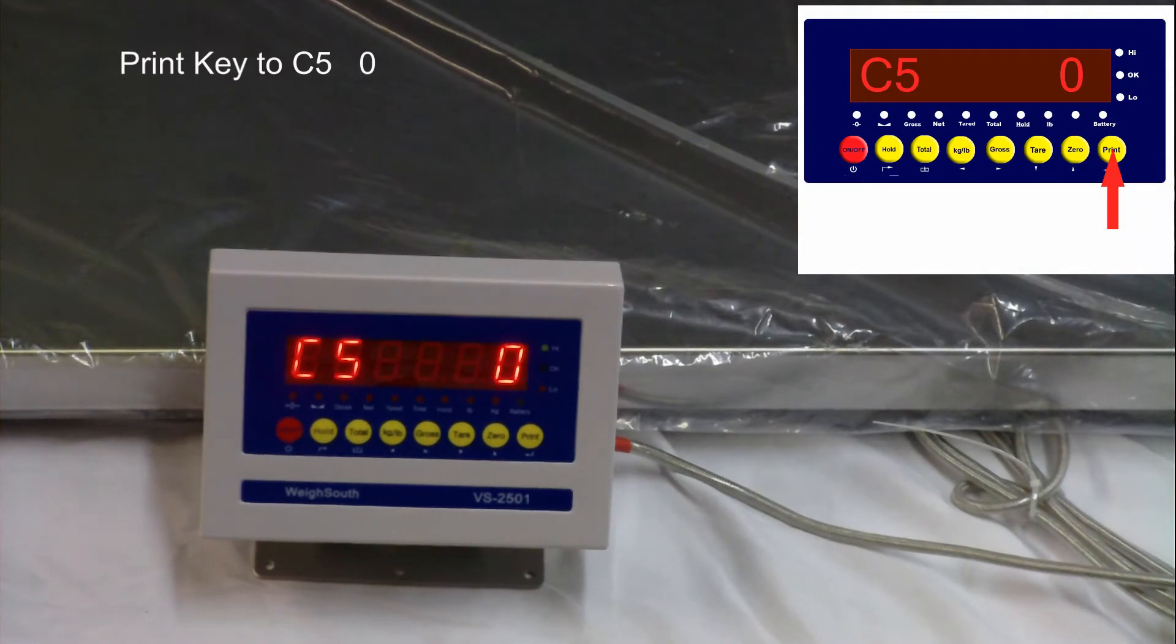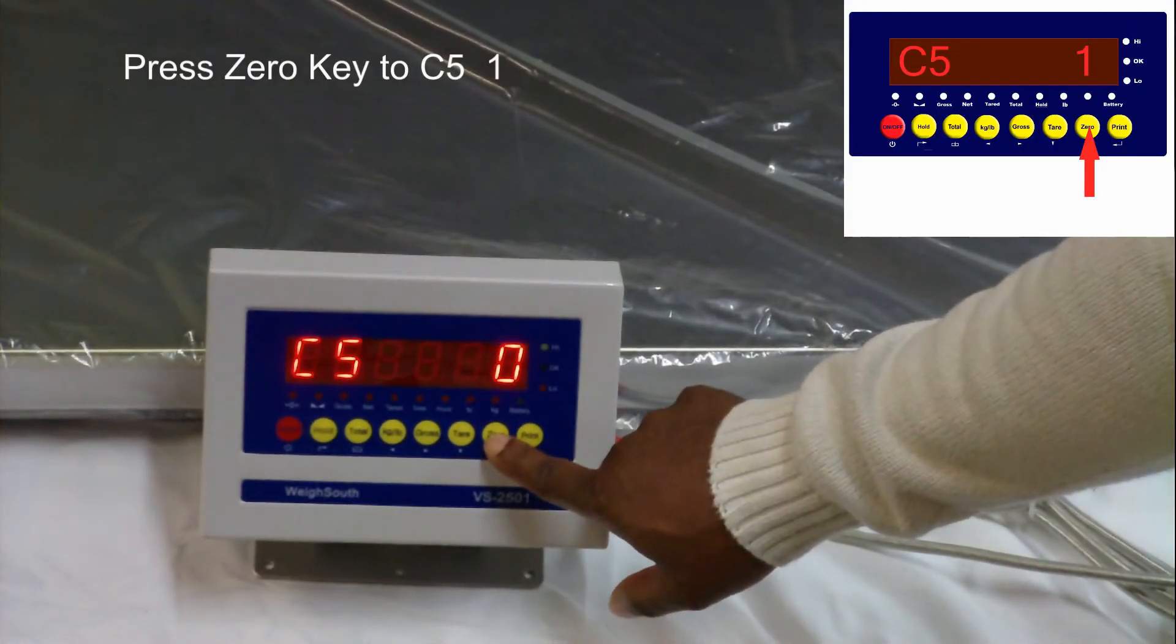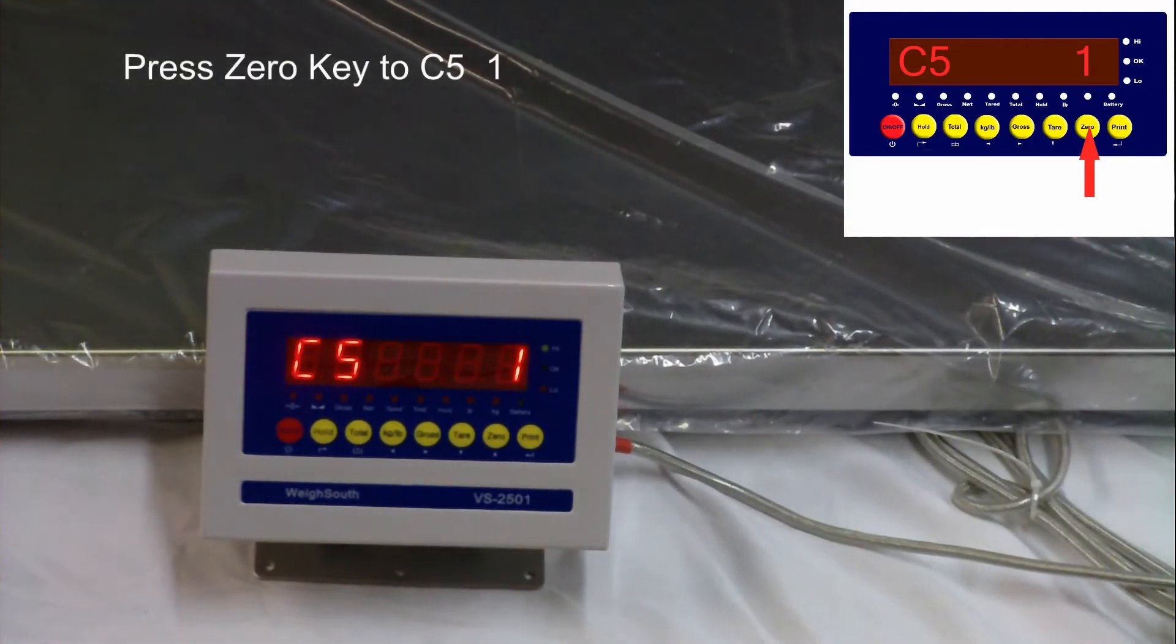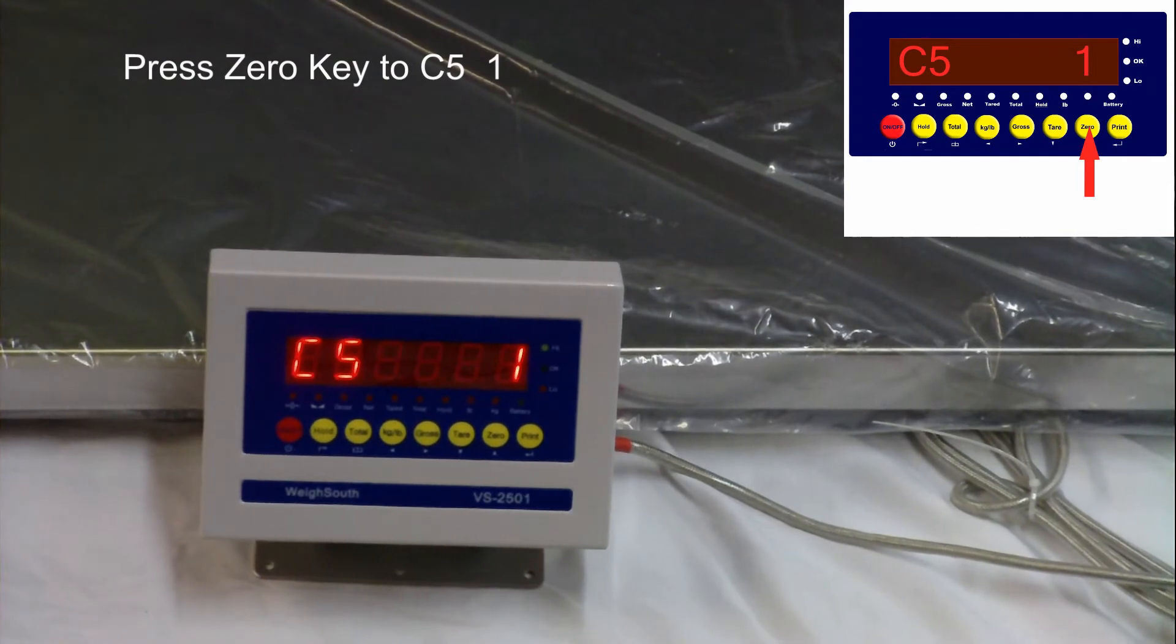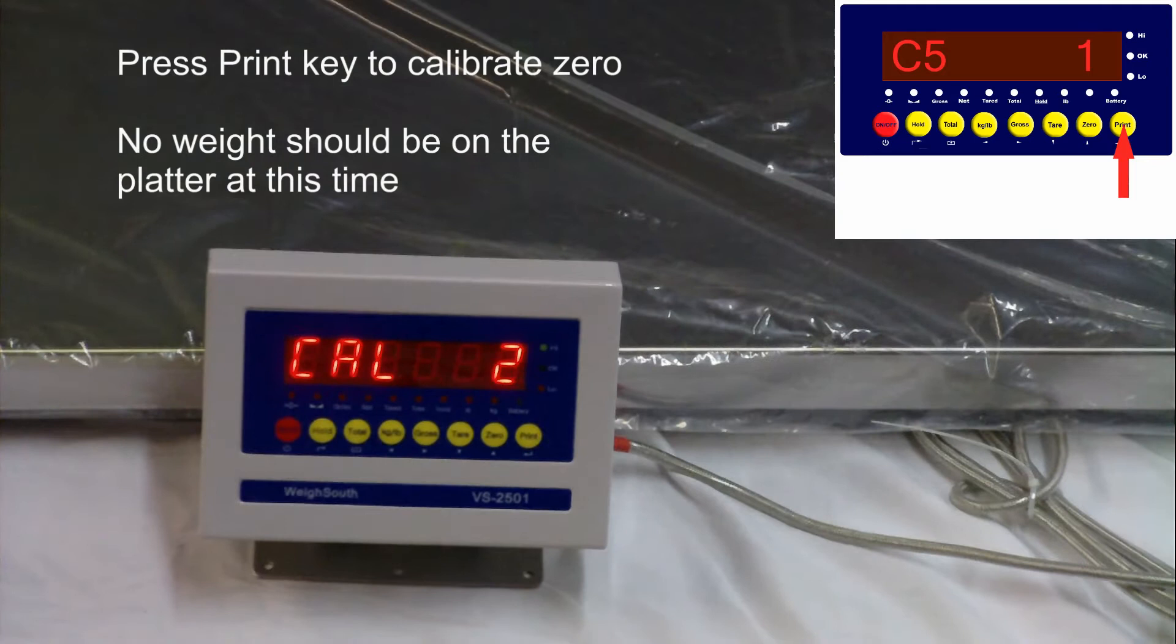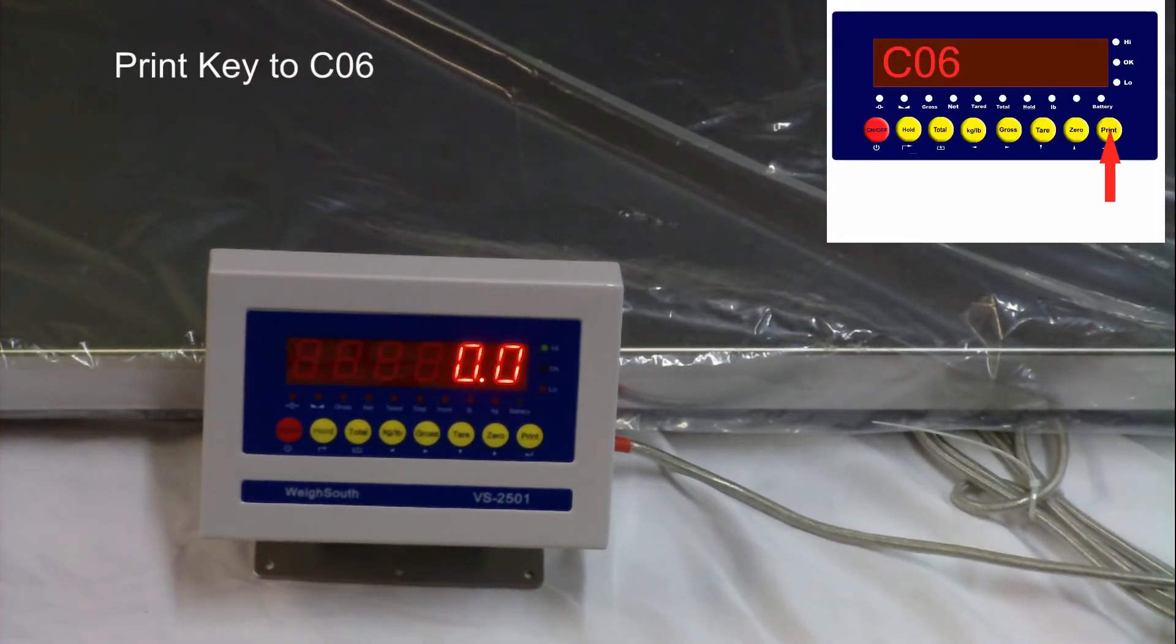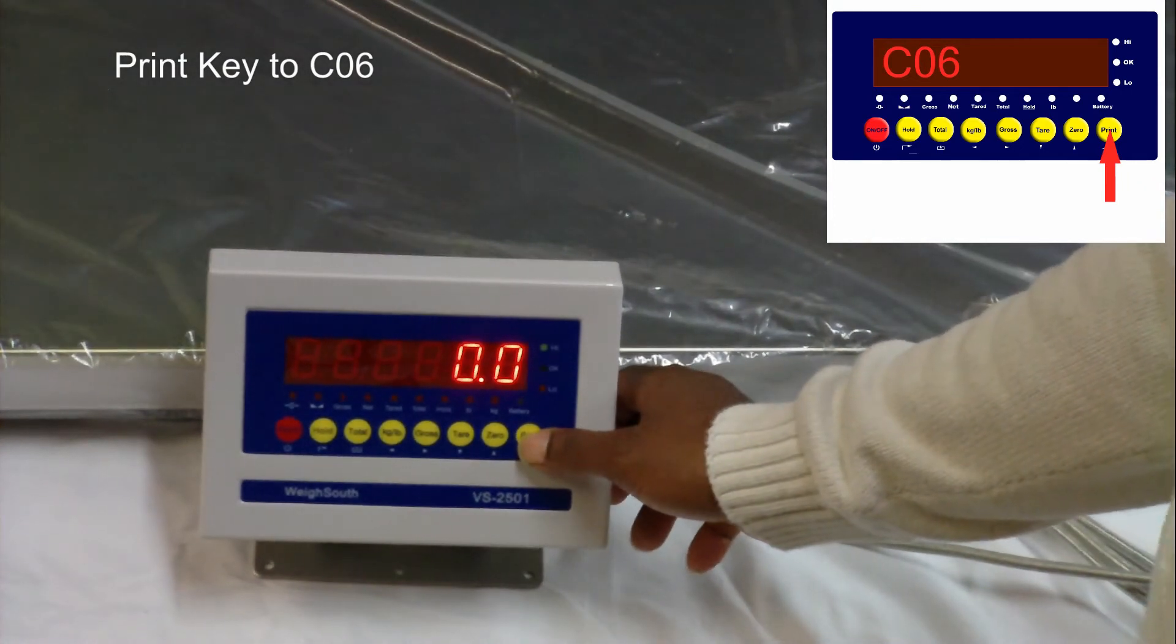To start calibration, make sure that the weighing surface is clear. Press the zero key to change the submenu from 0 to 1. Once set, press the print key to begin calibration. The VS2501 will display countdown and rest on 0.0, ensuring that the zero point has been set. Press the print key to move to the next C function.